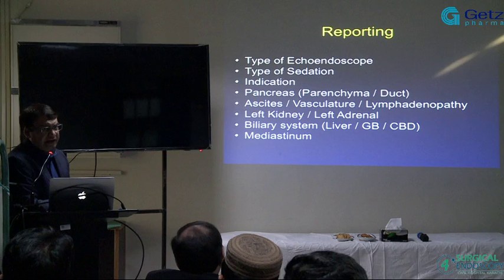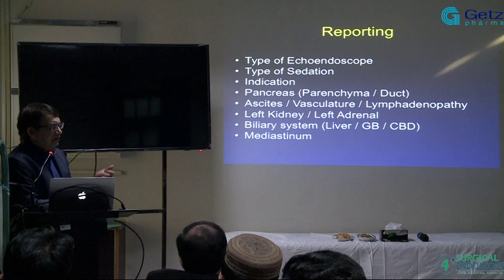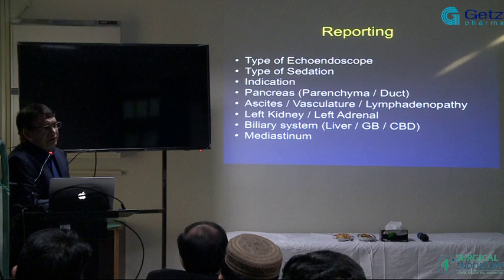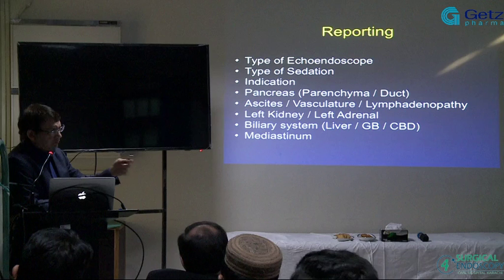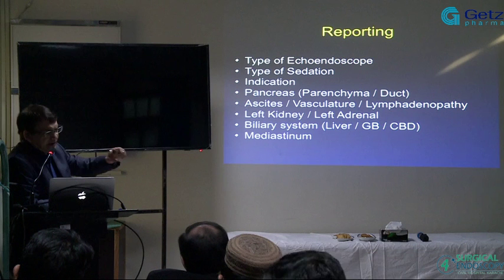Nowadays we have much, much better technology, especially with regard to vascular invasion and obviously with regard to the medications. So you cannot solely depend on EUS itself, and CT is complementary to that. So this is that part. You have to talk about the pancreas.